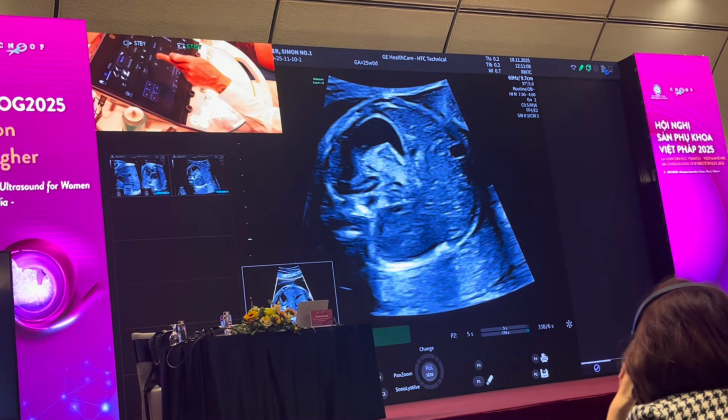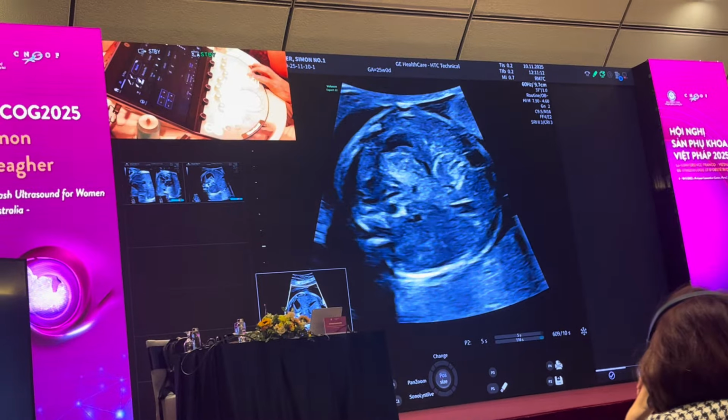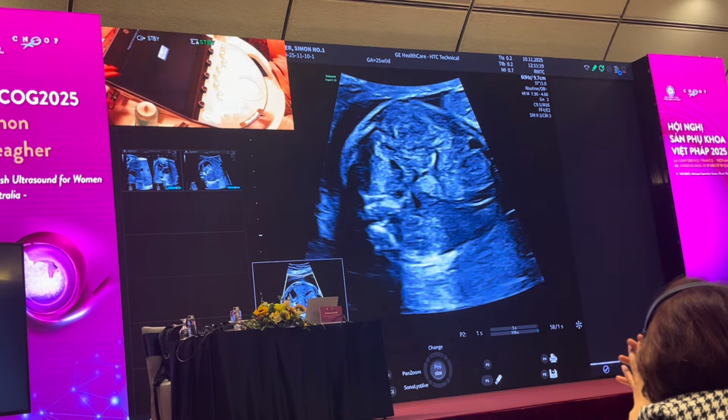Why was this not set up for prospective recording? Yeah, let's do this. I need retrospective. Do you want to set it up?